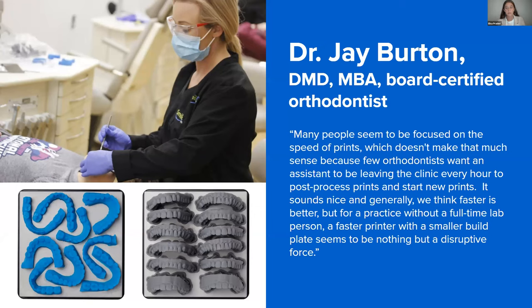Maybe sometimes having speed is a balance also of doing a practice arrangement overall. So also, knowing who will be managing this. Us professionals, delegating this to the dental staff, we need to prepare that accordingly. So it's a matter of restructuring your practice overall. And I think that once you target that, it's very easy because everything runs so smoothly and you reduce a lot of the time needed for the overall workflow. But I will touch base again on the advantages of adopting all this workflow and challenges in a couple of the following slides.